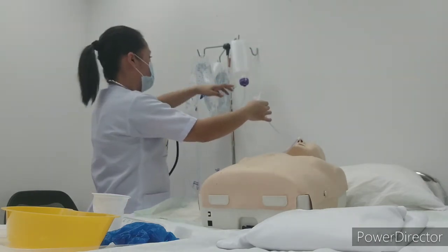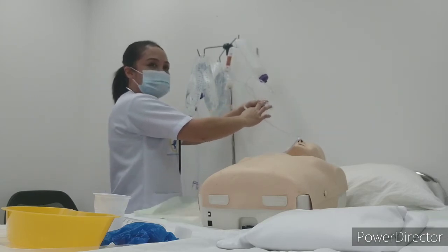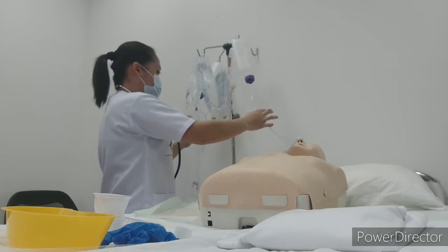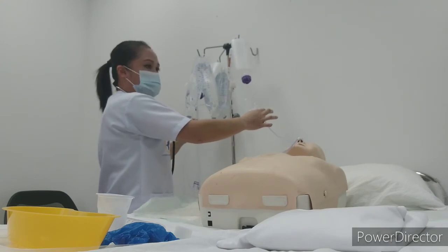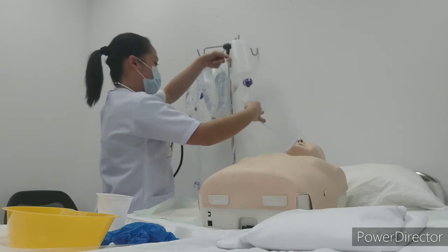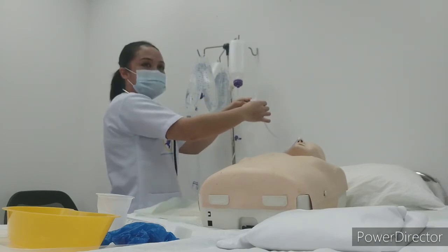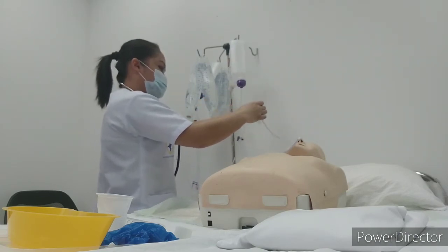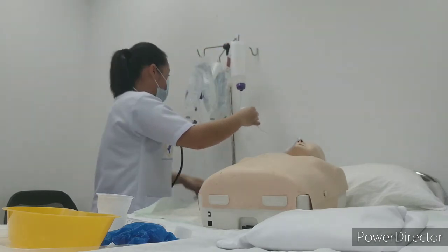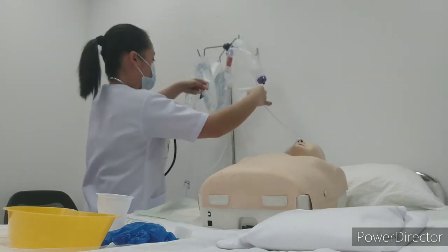So this one, the bottle, there is a part like this that you can connect to the machine. So in the machine you will input 1000 ml, and then according to the doctor's order, for example 200 ml per hour or per minute, like that. So the tip of this one, you can also use this direct. You can connect this one direct here. So for example, this one, I think yeah, it's bigger. So assuming this is the one, because it's bigger, this one you can put direct.